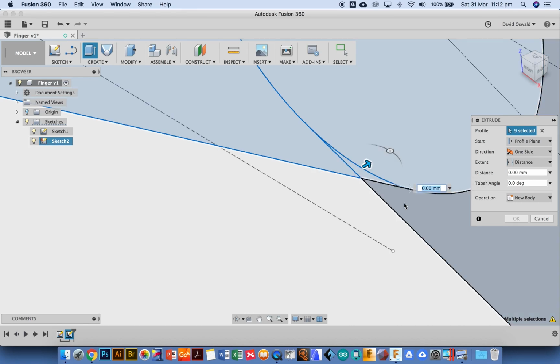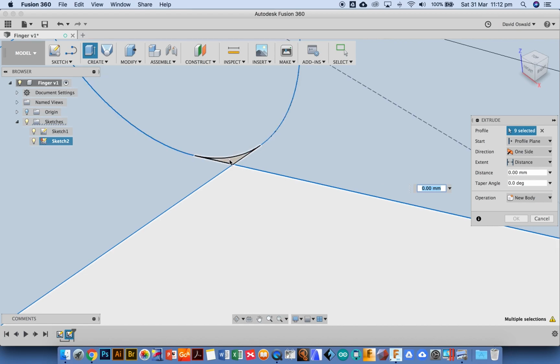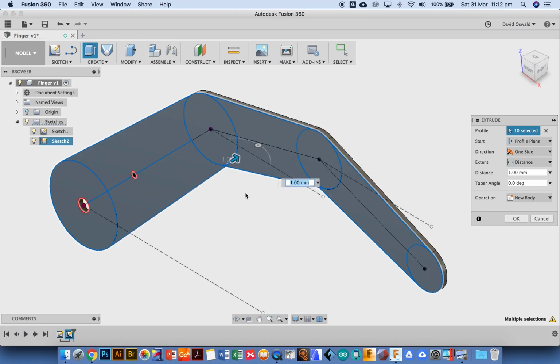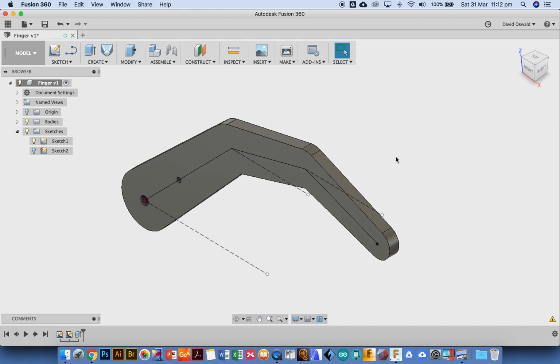I need that piece there. And I need this piece here. Everything should be light blue that I'm going to extrude. And then just drag that out. Type in 3, enter. And you've got a finger that we can use. Perfectly done. I can turn these line works off if it gets confusing.